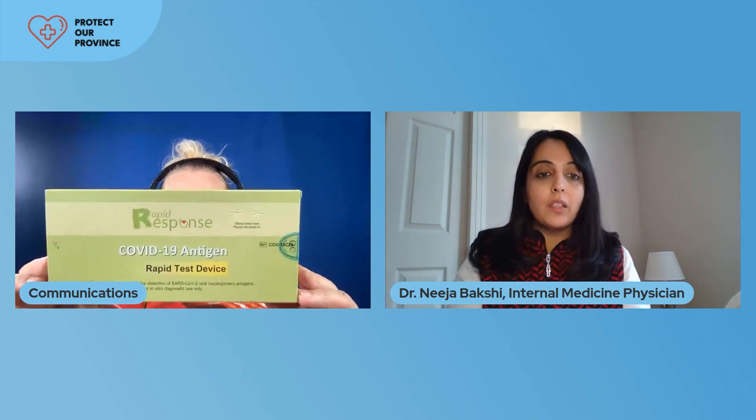Welcome everybody to this special presentation of the province's rapid antigen test. We are going to take you through how to perform the rapid test at home. Today we're going to be demonstrating the BTNX rapid tests that are available in select pharmacies.